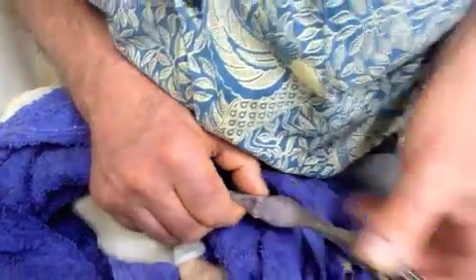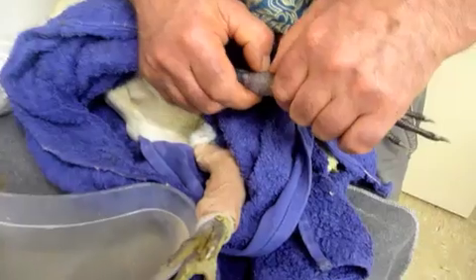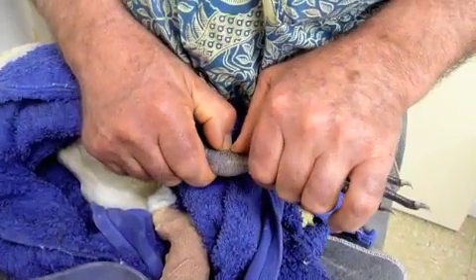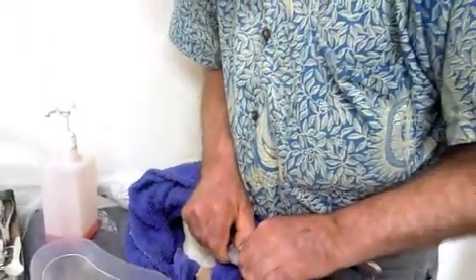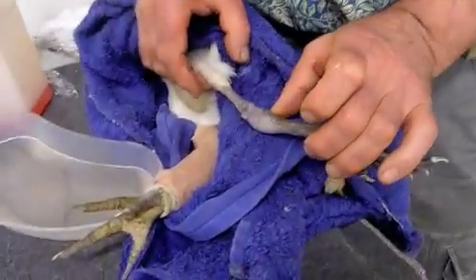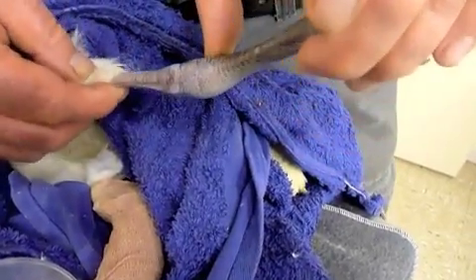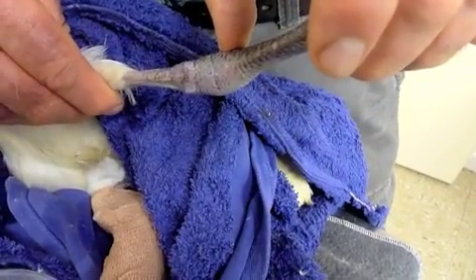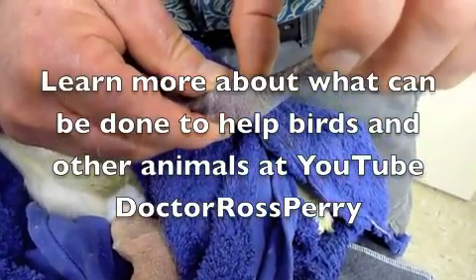An improvement, not quite everything we want yet. We can see now that we've managed to over-correct — if I hold pressure on the foot and use my thumb as a pivot, we've now got the leg more than straight. So we're at a point where I can apply an external pin apparatus to keep it straight. That'll be the next step.